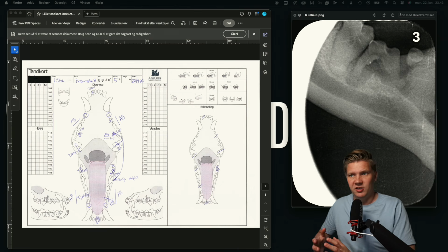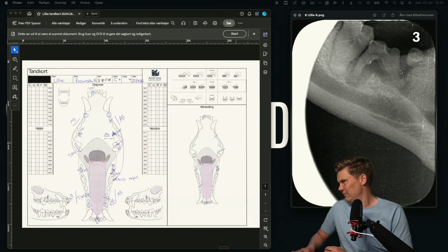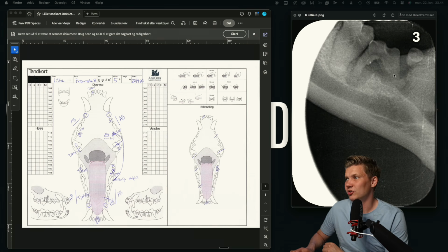So we flip the patient now upside down, and now we will take the mandible. So this is in dorsal recumbency, and here we start with the back molars of the third quadrant, so left side. And this is some severe pathology right here. You see 310 and 311 have been completely destroyed here by bone loss. You can see all this radiolucent area. You can see the tooth root that is resorbing. And on the dental chart, you can see I noted XX because you have to extract.